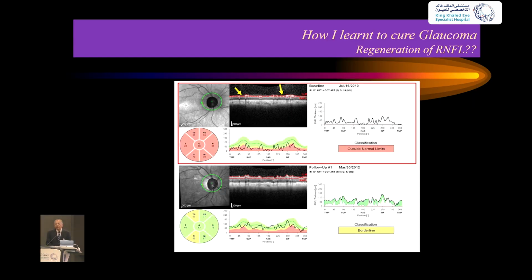And this is how I learned to cure glaucoma in my pastime. You see, this patient came in 2010 without hardly any nerve fiber layer. In 2012, this patient has all their nerve fiber layer back. Is it possible? Yes, it is possible.